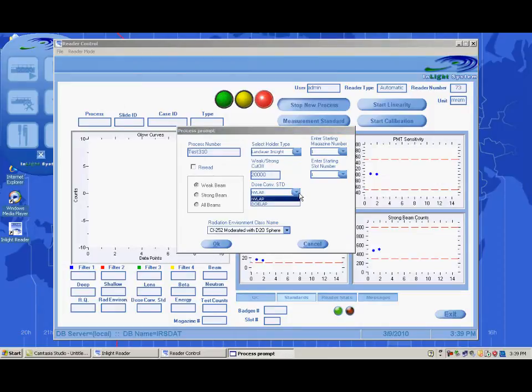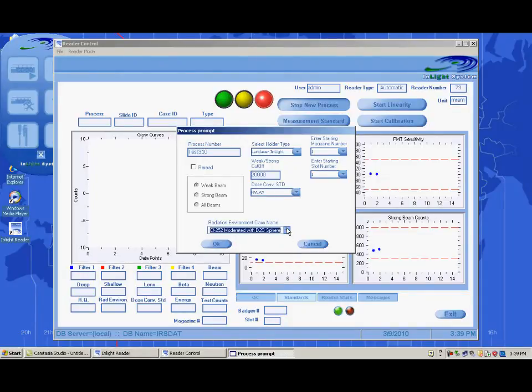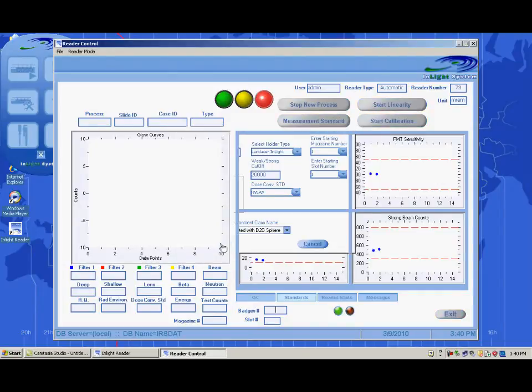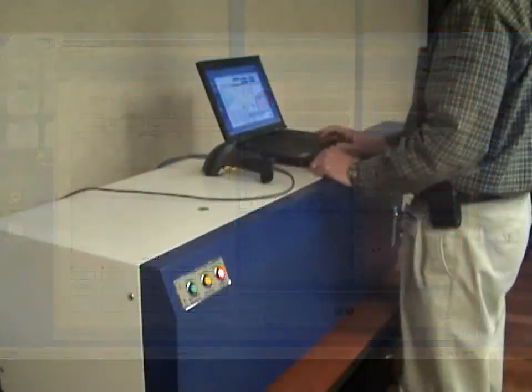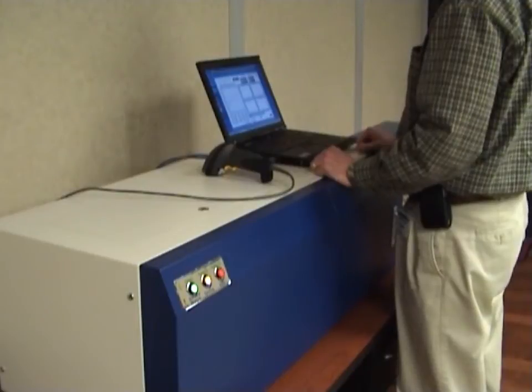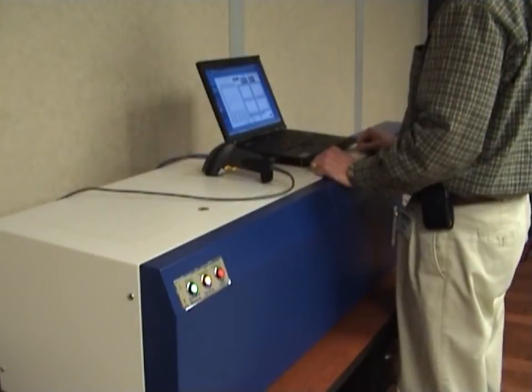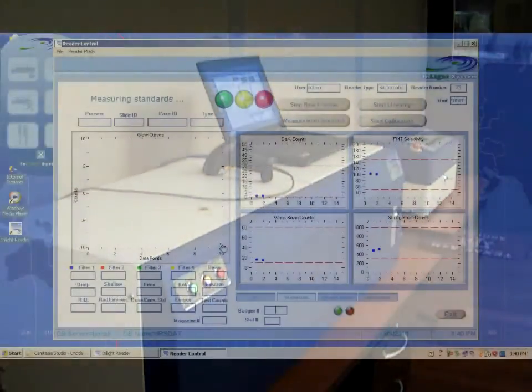Select the proper dose conversion standard. If using the albedo dosimeters, select the Radiation Environment class that should be used for the neutron calculation. Click the OK button to begin the reading process. Before reading the process, the reader will perform a standard measurement test.